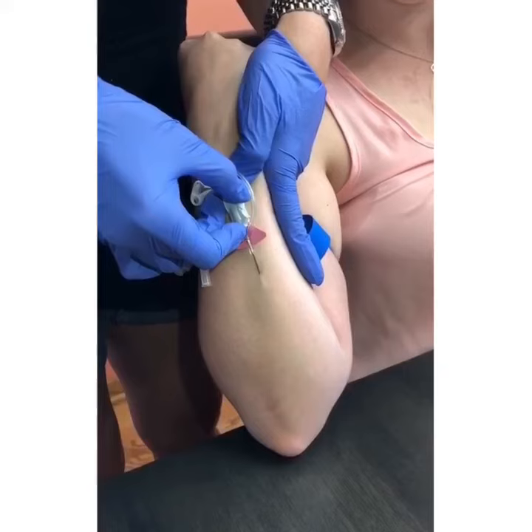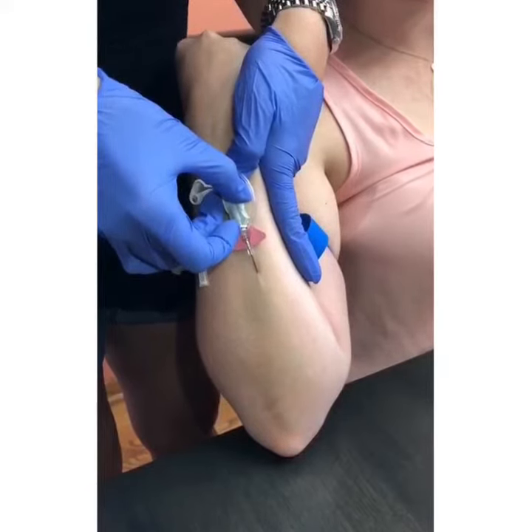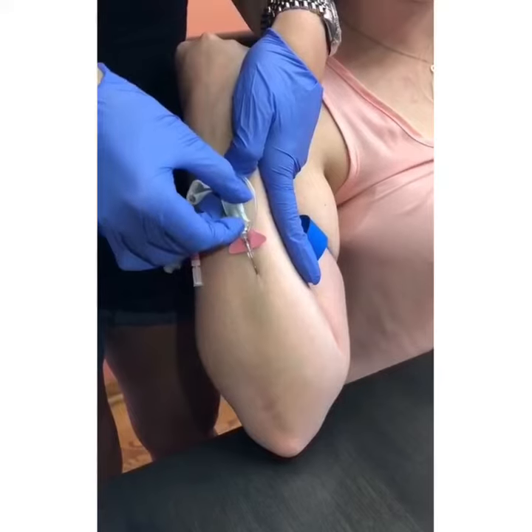Once you see the flashback of blood, continue the needle another one to two millimeters and then pull back your needle before you advance the catheter.